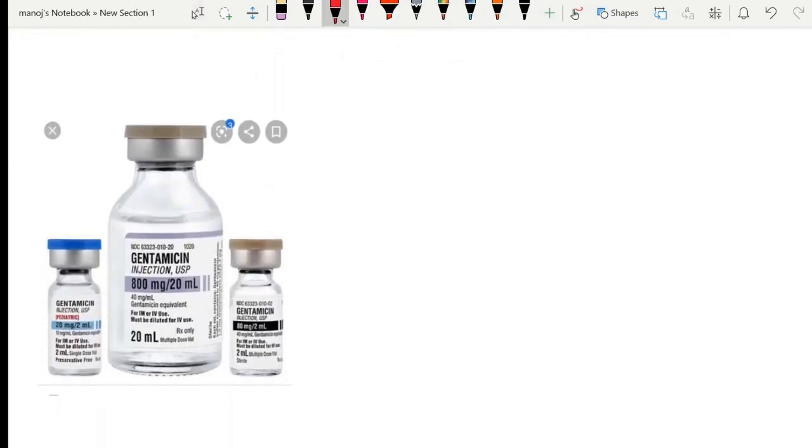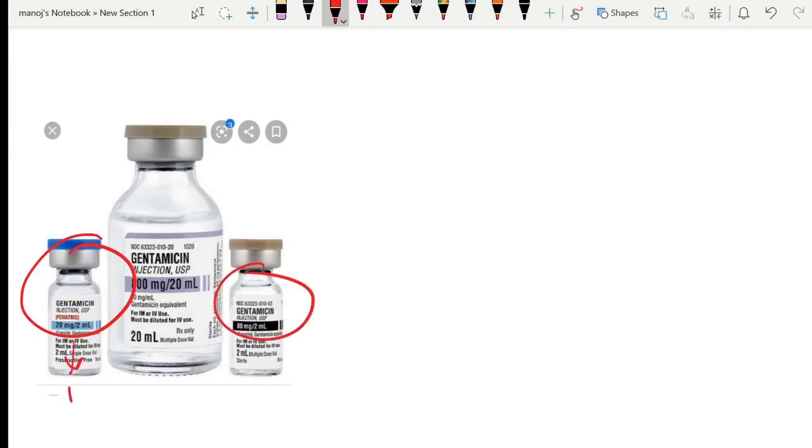Gentamicin is usually available in three formulations. One is the small vial which contains 20 milligrams. This is another formulation which contains 40 milligrams. Here, one ml contains 10 milligrams.